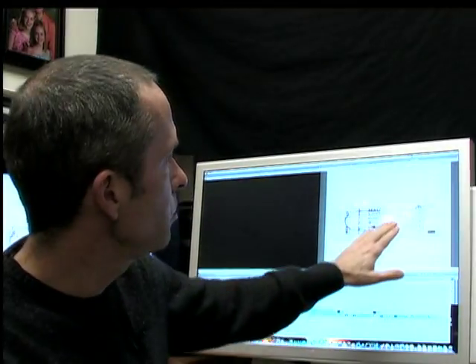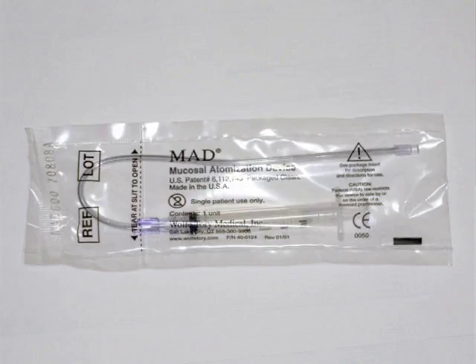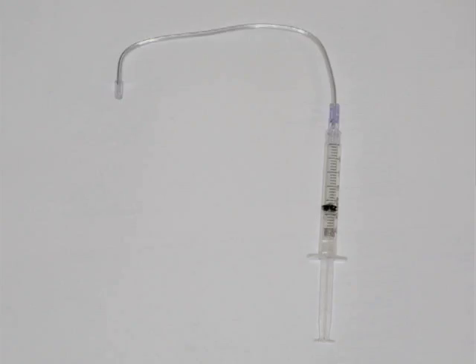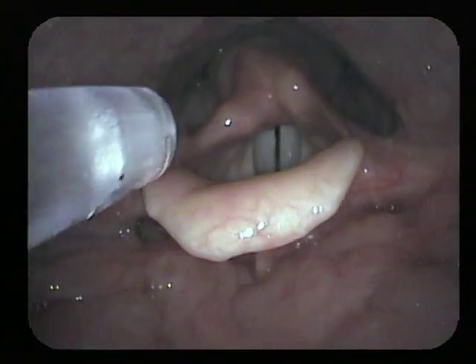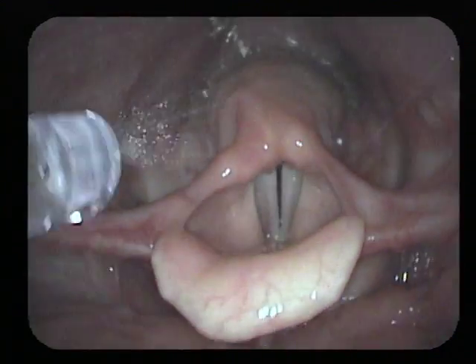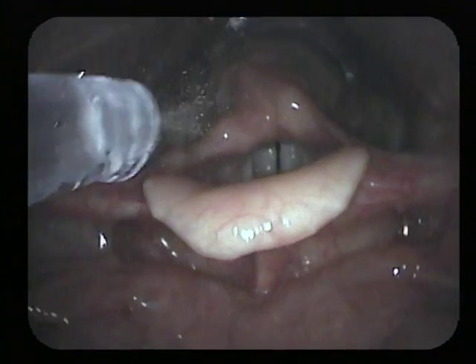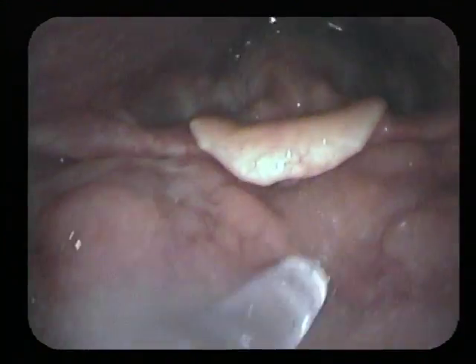The second way: there's a device called the mucosal atomization device. It has an atomizer on its tip, and you can bend it so it goes around the tongue and aims down the throat. The atomizer blows the spray around — and of course the patient gags anyway, so it gets all around.